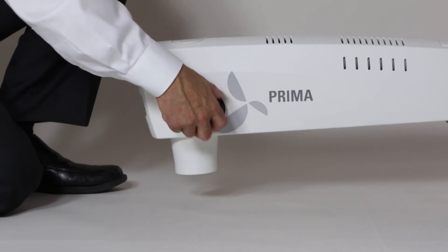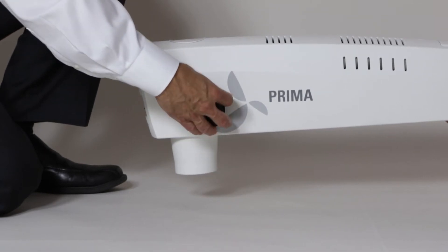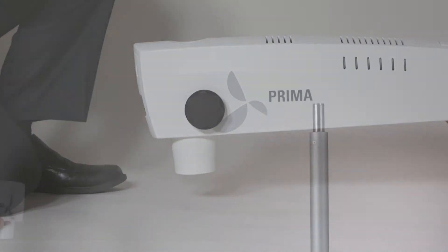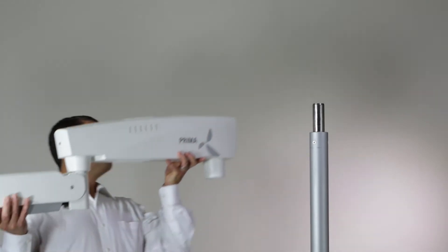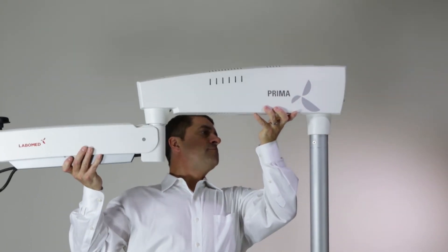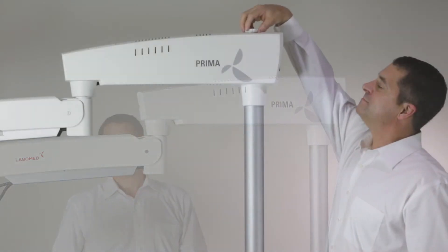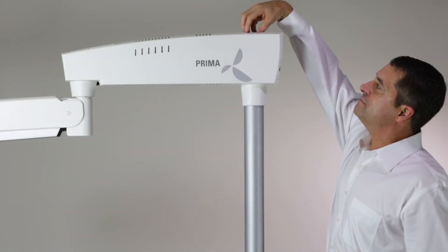Loosen the tension knob closest to the power switch as much as possible and remove the dust cap at the top. Place the arm onto the column. Ensure the lip covers the three screws at the top of the column. Insert the cap screw and put the dust cap back on.